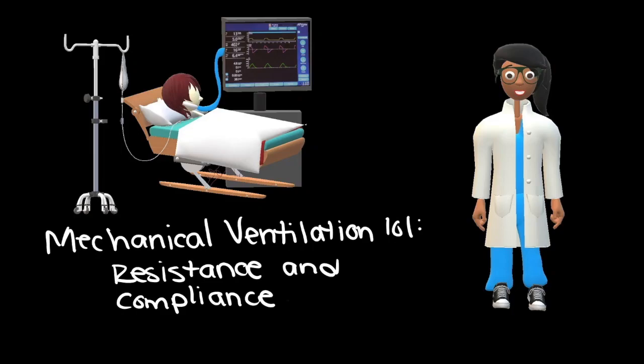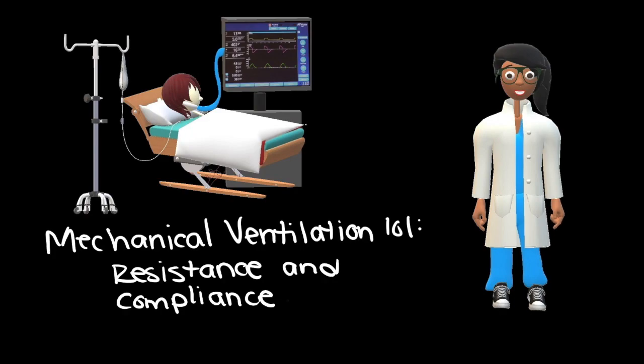Now that you know about the basic modes and parameters for mechanical ventilation and you have your patient Sarah intubated on volume control, let's get into resistance and compliance so that you can start troubleshooting the vent.